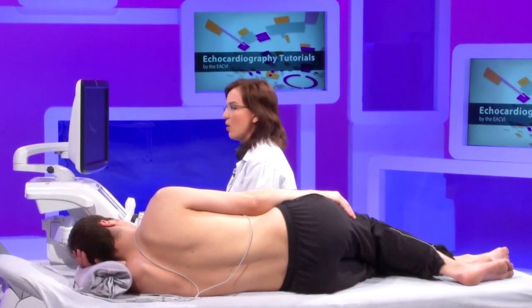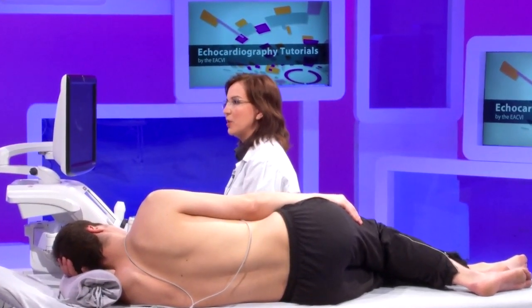For the echocardiographic examination of any patient with tricuspid regurgitation, you should be able to follow a certain sequence. First, you need to define the mechanism of regurgitation, then assess its severity, assess the consequences of the tricuspid regurgitation on the right heart chambers, and finally also assess the pulmonary pressure.